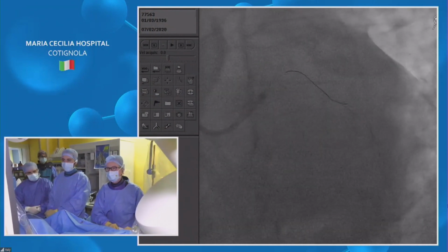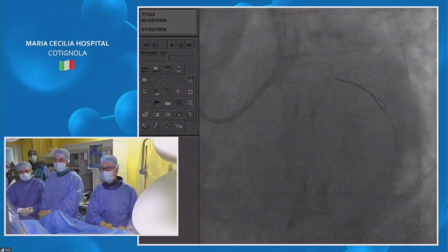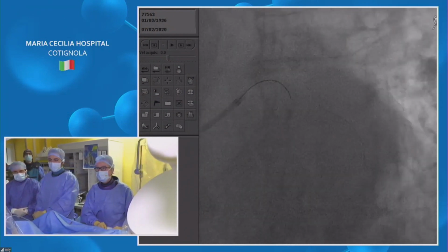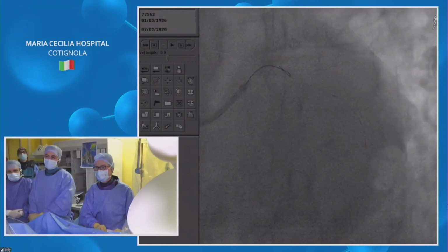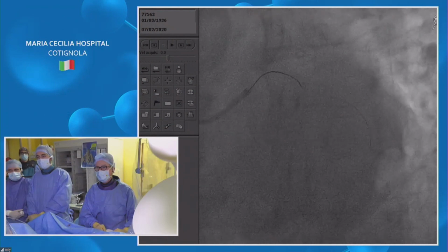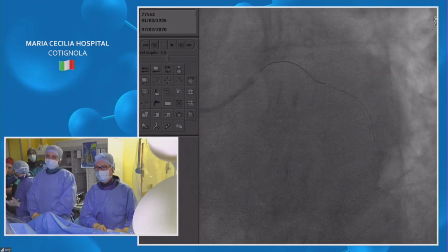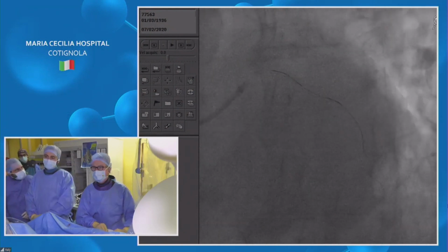Origins and spread out. Let's take a picture in the spider. This one is a little bit beaten up, but it's okay. Take a picture.